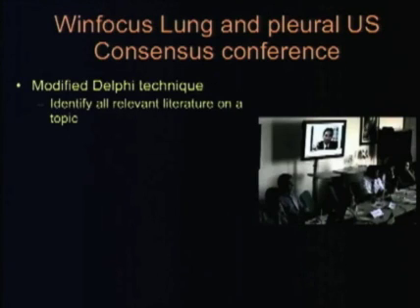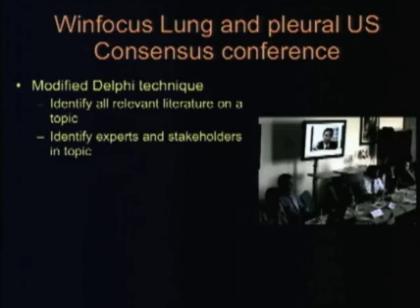But there has been a consensus conference that's been held using the modified Delphi technique under the aegis of Winfocus. The conference was held in various cities in Rome during 2010 and early 2011. And using this technique, which I'll describe briefly, consensus ideas about the use of lung ultrasound are rapidly emerging.